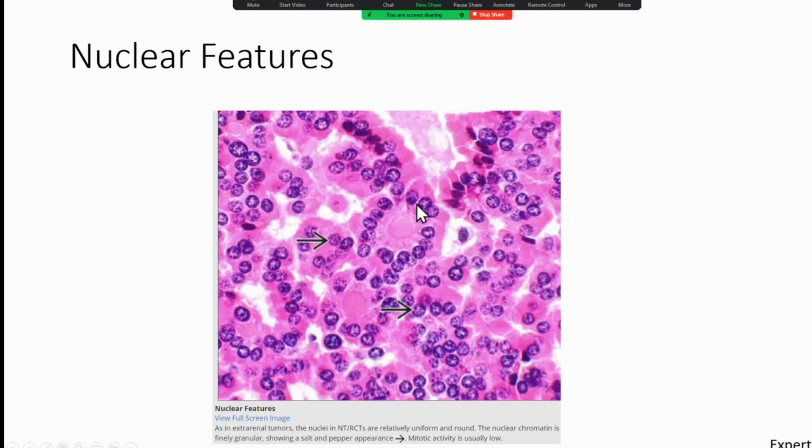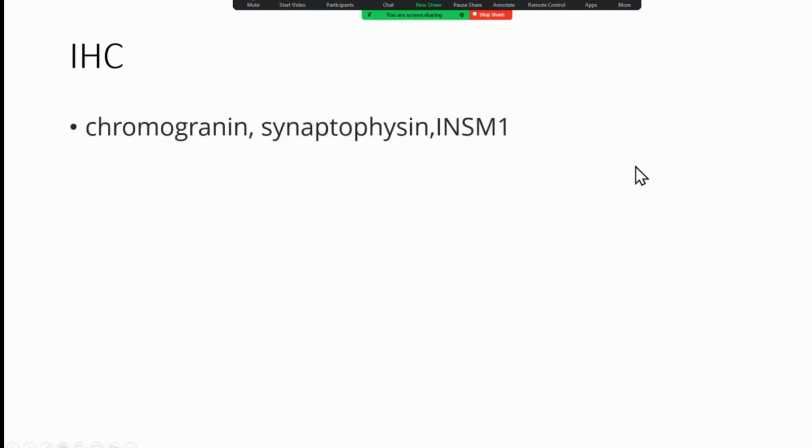And you can see each of these neuroendocrine tumor cells respects each other's border. They don't overlap with each other or have any nuclear molding. So this feature is really characteristic when you see the next two entities I want to show you.